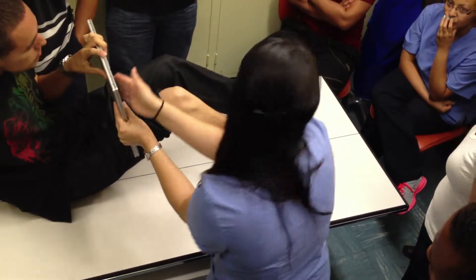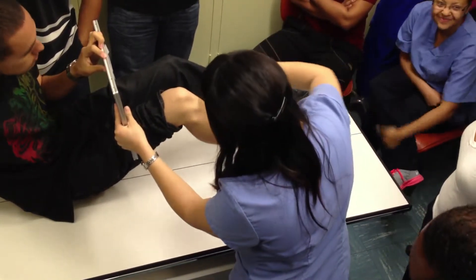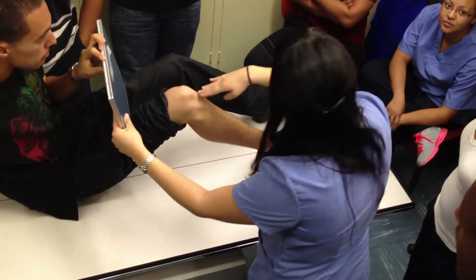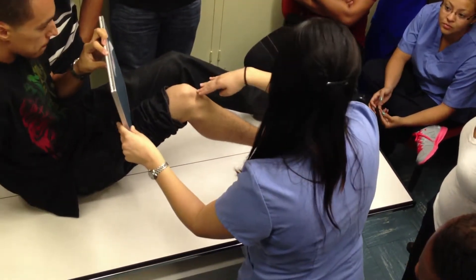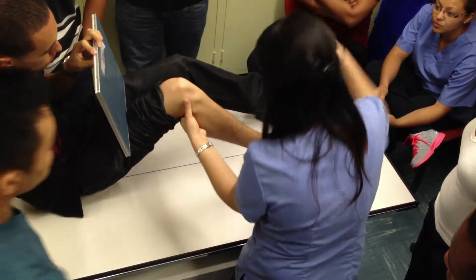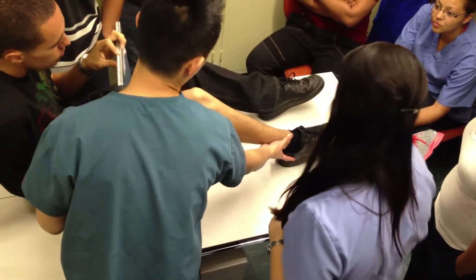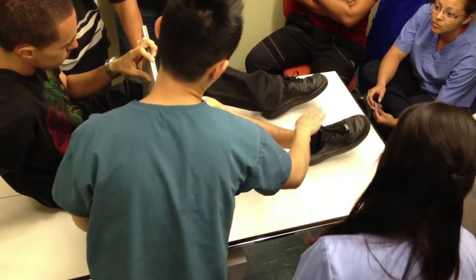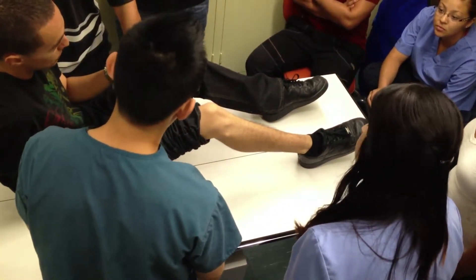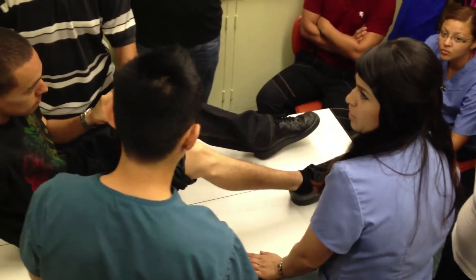Have the patient hold it. Your CR, depending on the flex, can come in either perpendicular or at an angle. The angle honestly just depends. You can come in perpendicular — that makes it easy so you don't have to figure out the angle. It just depends. Another way is to bring them out to the edge of the table.